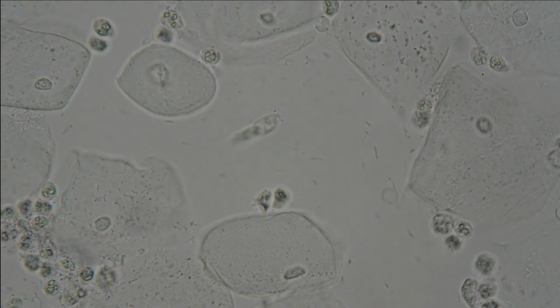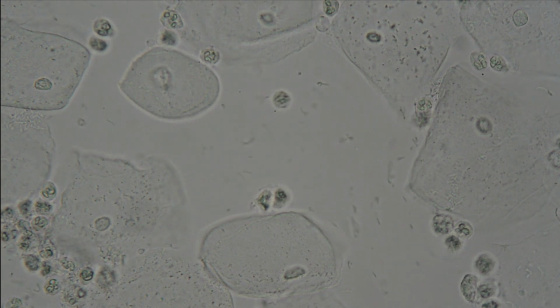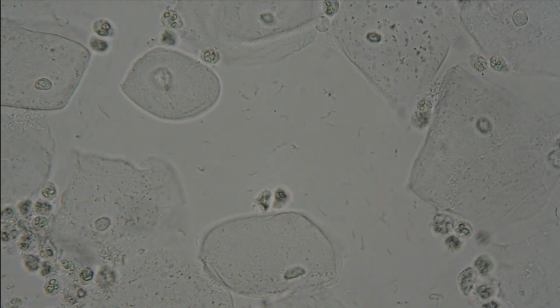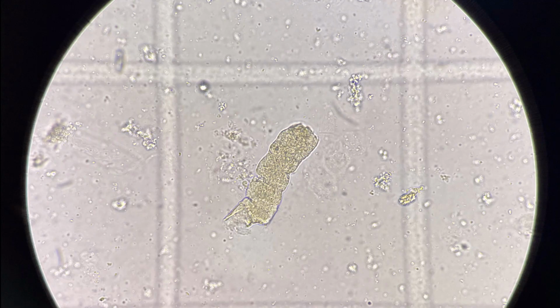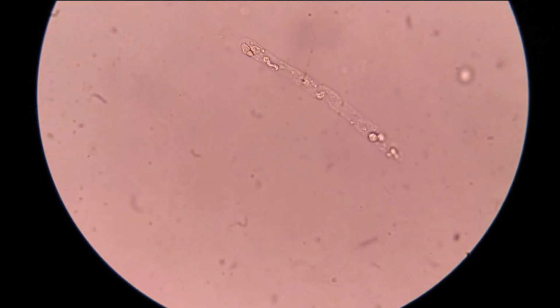Epithelial cells, found on the skin and in the lining of the urinary tract, may suggest inflammation or kidney damage, or it may be simply that the patient did not perform a clean catch correctly. Casts may also be seen in urine. Casts are tube-shaped particles, made from a protein called uromodulin, that can be indicative of different renal conditions. There are many different types of casts, such as hyaline casts, granular casts, RBC casts, and WBC casts. The most common cast seen in urine, though, is hyaline.